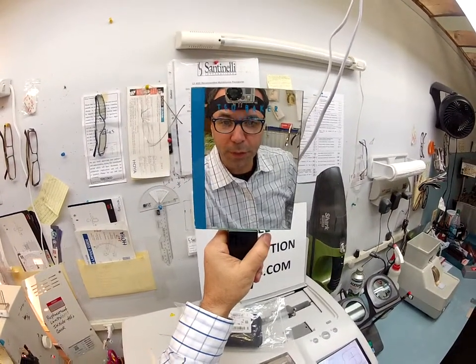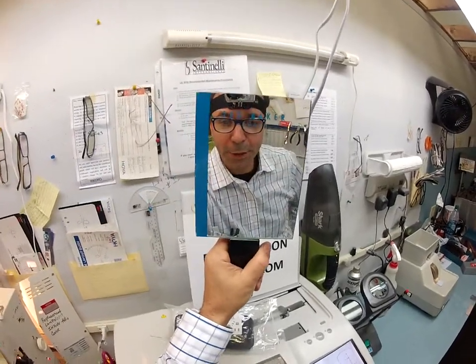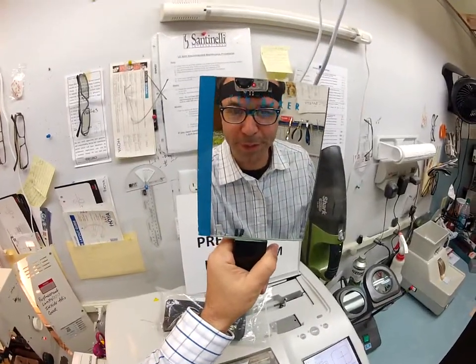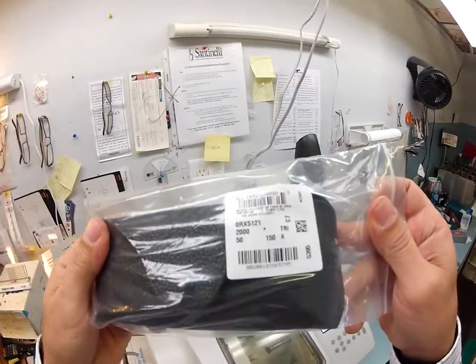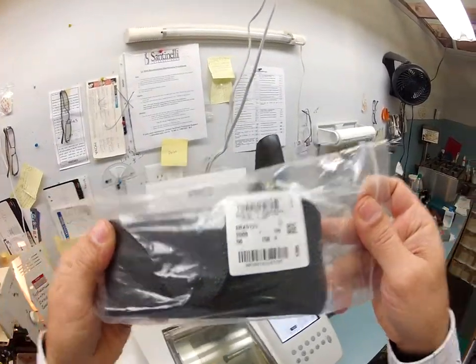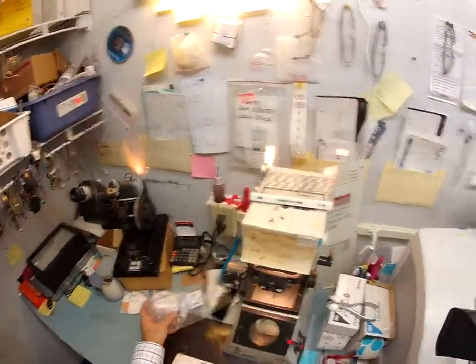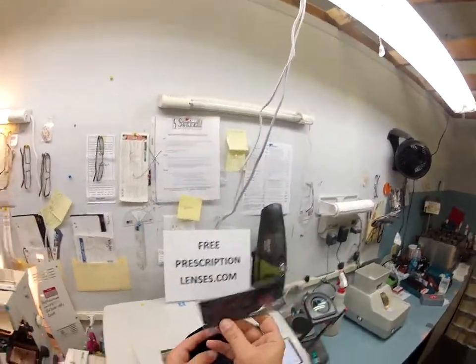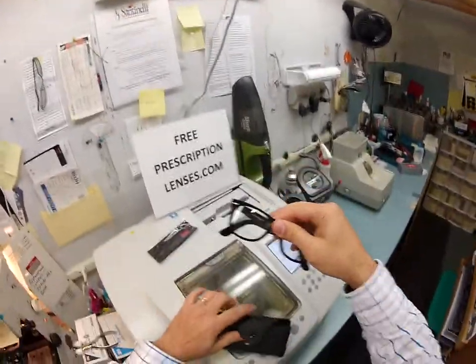Hey, it's Matthew here with freeprescriptionlenses.com. Aluino, my noble friend, I'm going to show you how I cut transition lenses with anti-glare coating for your new Ray-Ban 5121, color 2000, size 50. It is the Ophthalmic Wayfarer. Let me take it out of its case — the Italian leather case, the cleaning cloth, and last but not least, your Ray-Ban frame.